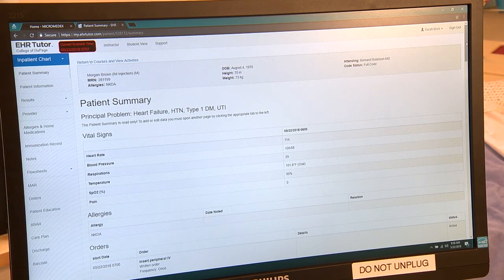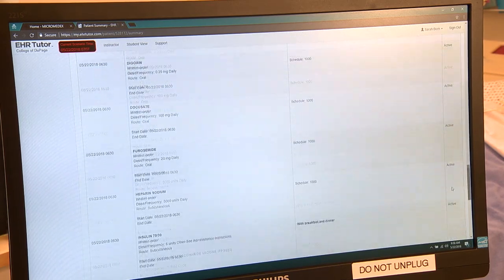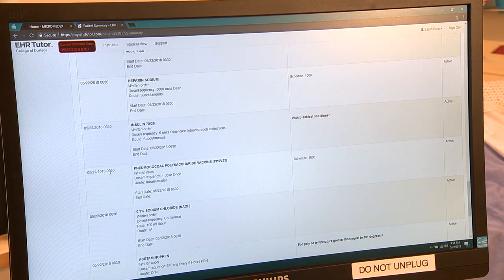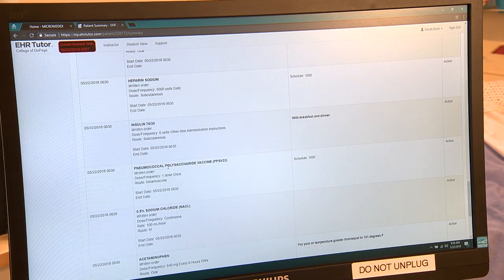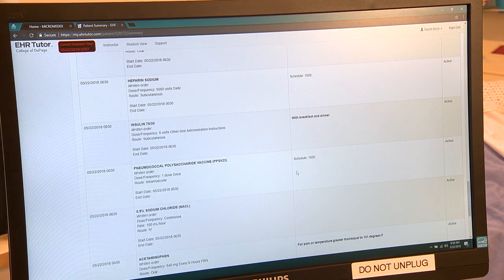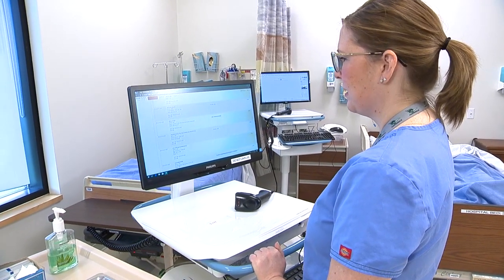Now I'm going to look for my order. I see that today, 5/22 at 6:30 AM, the doctor ordered a pneumococcal vaccine one time to be given IM, due today at 10 AM. Now I'm going to go to the med cart to grab my supplies.